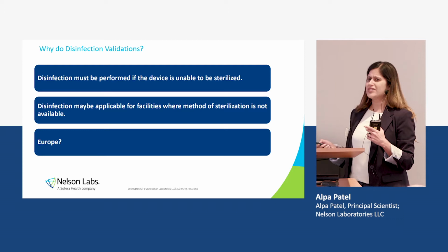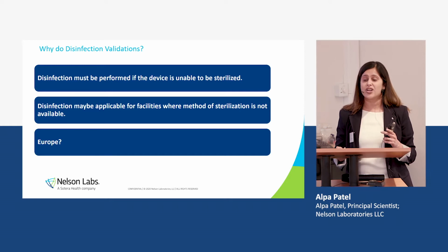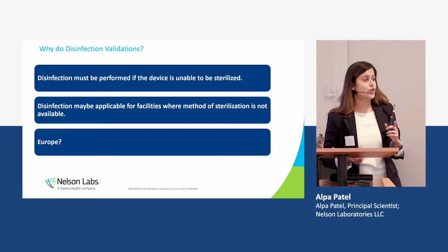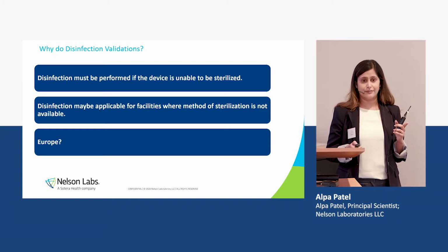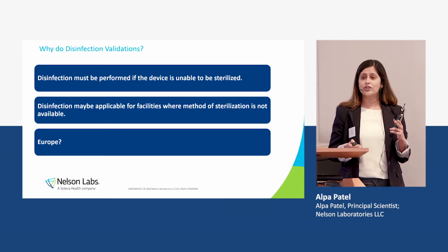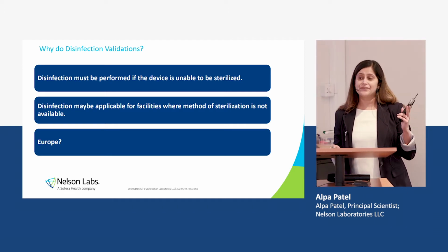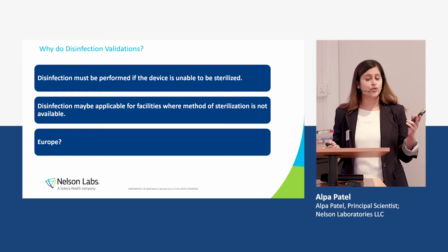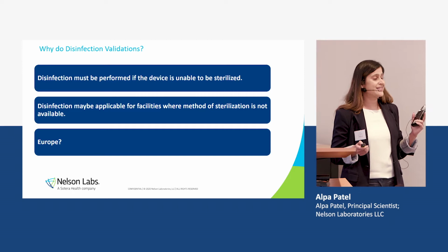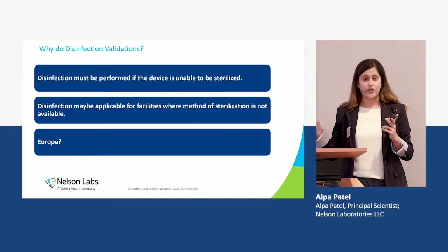Now, why would you use disinfection and not sterilization? Disinfection is more applicable to devices that cannot withstand high temperatures. And also devices that are sold in countries that don't have sterilizers in place or clinical areas. A lot of third world countries, they can do the manual cleaning, but if they don't have a sterilizer, an autoclave, how are they going to decontaminate? And even if it's a critical device, many countries will put it through a high-level disinfection because at least it's some sort of a safety margin that they're adding to that. So that is when you would choose one or the other.